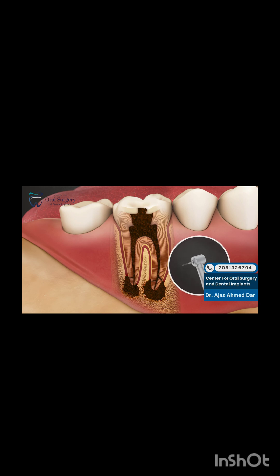A root canal procedure involves gaining access to the root by entering the canals from the crown of the affected tooth and removing all of the decayed tissue. Each tiny canal is then identified, cleaned, and disinfected using small, narrow instruments called files.